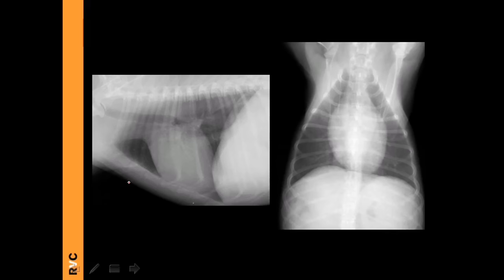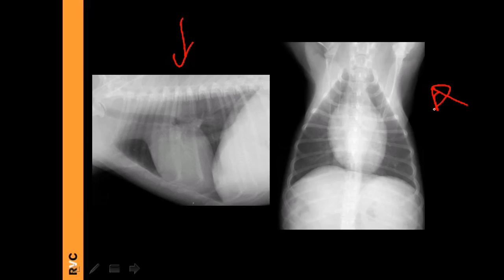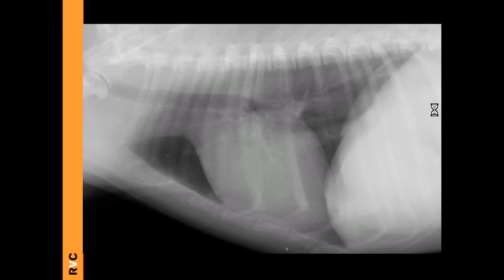The thorax is normally lucent, and the lung is totally lucent — it contains vessels and bronchi that give this opacity. We have to look at both the lateral and VD or DV view, so that every organ is evaluated on these orthogonal views to get a three-dimensional appearance. We use radiographic signs: number, size, shape, location, margination, and radiopacity. I will go first on the lateral, then on the VD/DV, to go through the various views and see how they look normally.